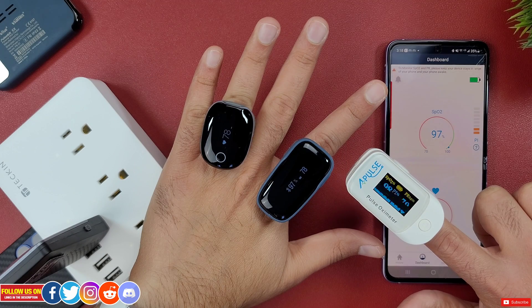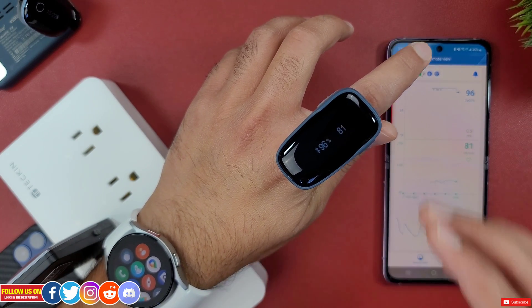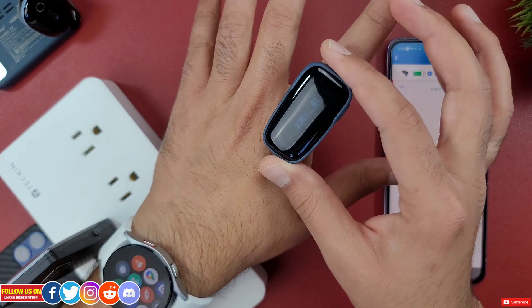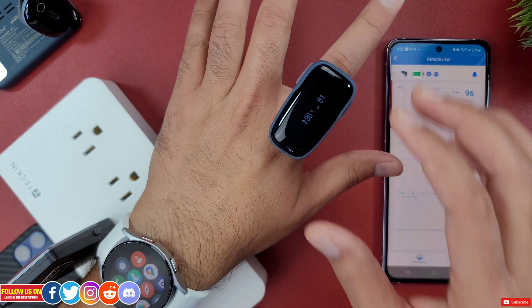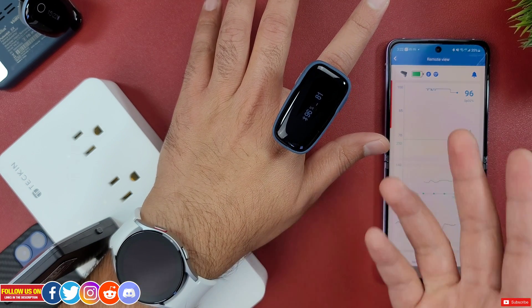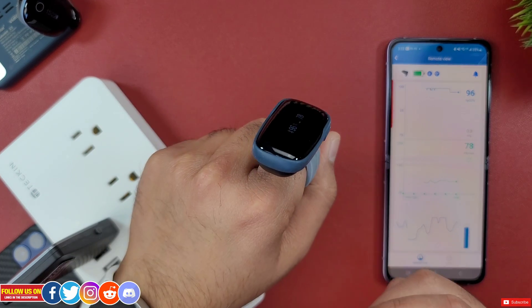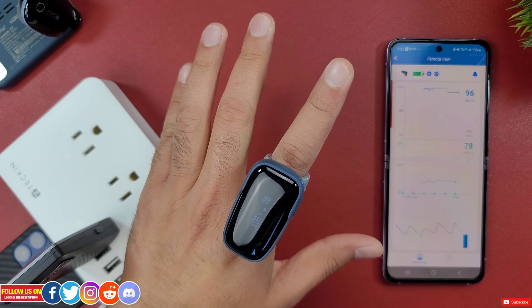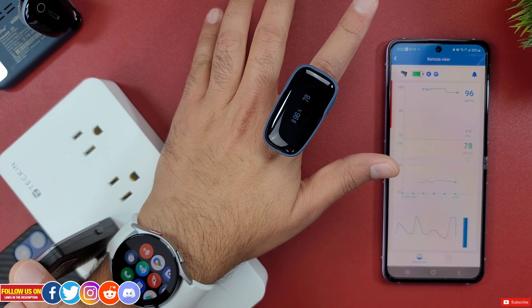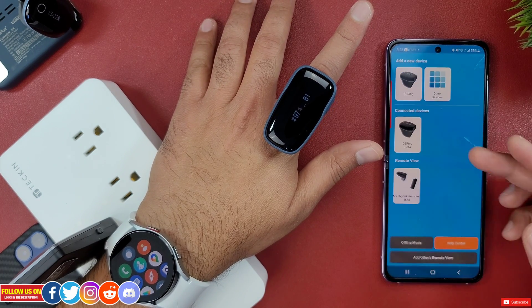In final thoughts, the OxaLink Remote oxygen monitor is a very versatile way to keep track of loved ones' vital signs — heart rate, oxygen, and even movement. The remote linker gives you the option to receive alerts if vital signs change beyond set limits, remotely anywhere around the globe. The setup process for both the device and remote linker is super easy, and the V Health app is very user-friendly and easy to navigate.